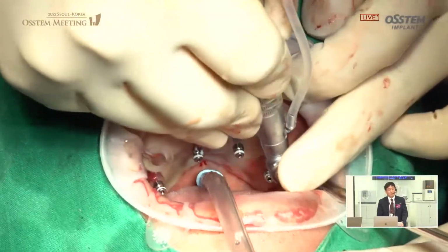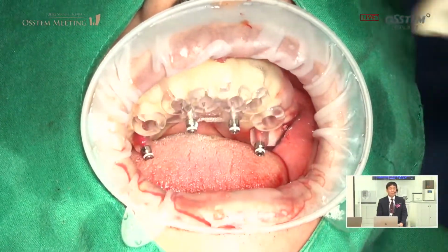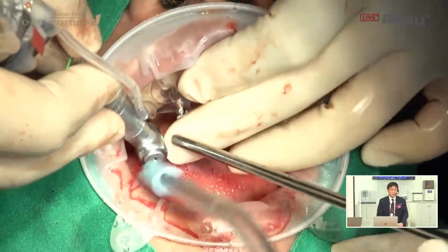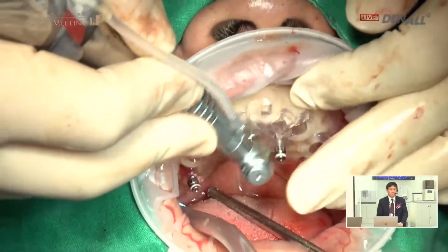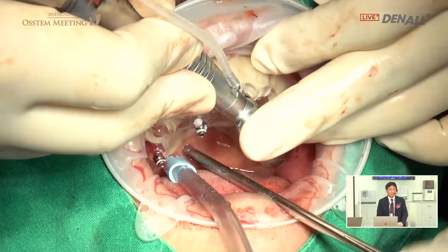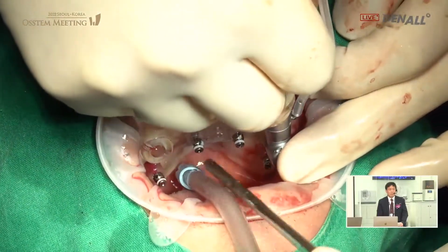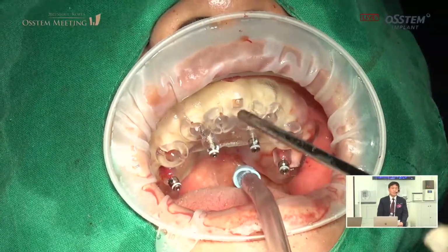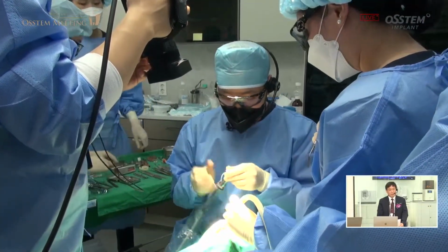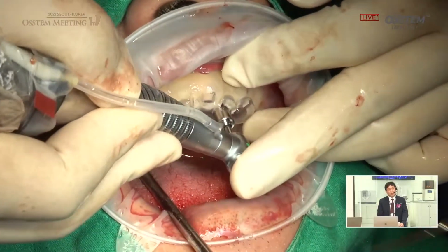So if you use a treatment denture, and do a reverse scan and make a guide, the denture, the guide, and the temporary can be made. So a combination of prosthetics can be used to maintain the occlusal plane.